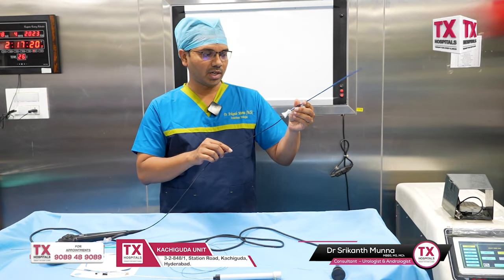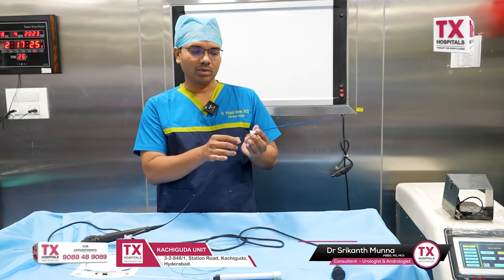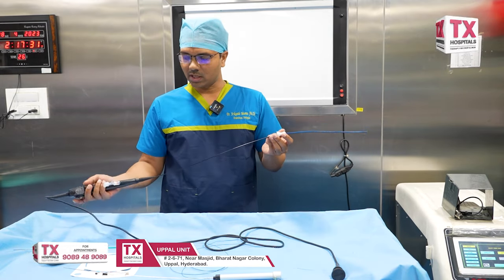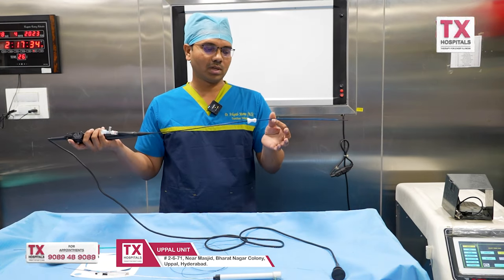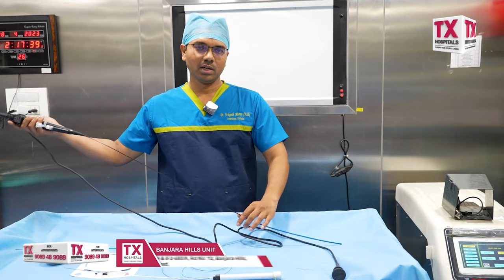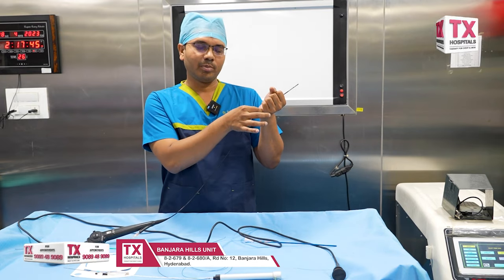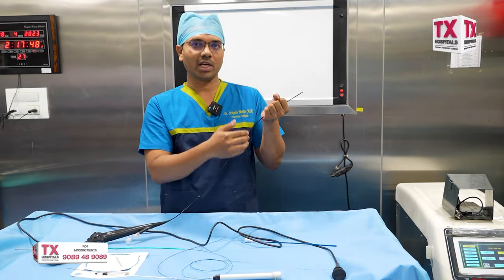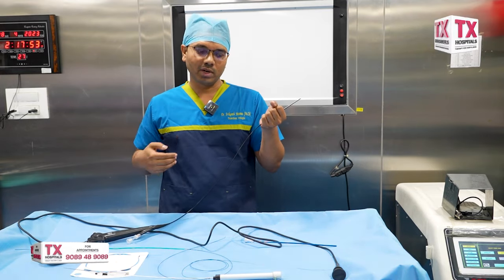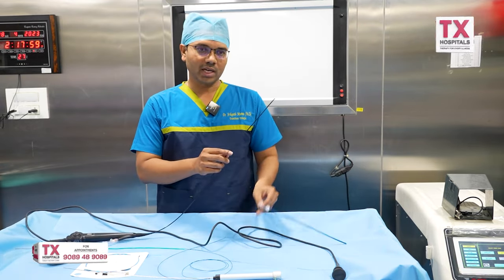The access sheath allows the advantage of normal saline fluid irrigation — the fluid continues to trickle throughout the procedure drop by drop. In a few centers, we don't have access sheaths yet. For a simple stone, easy cases, we use the access sheath. We use the irrigation fluid and a pump. Without the access sheath, pressure builds up in the kidney causing post-operative fever, sepsis, etc. So the safe approach is to put an access sheath.